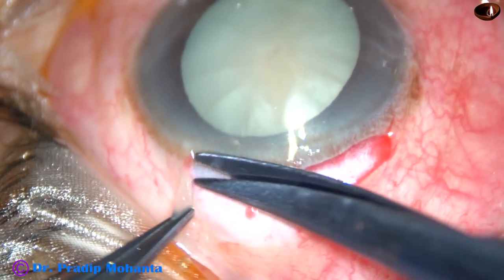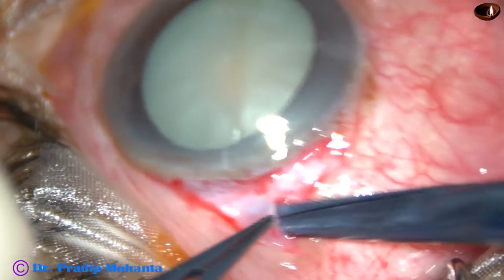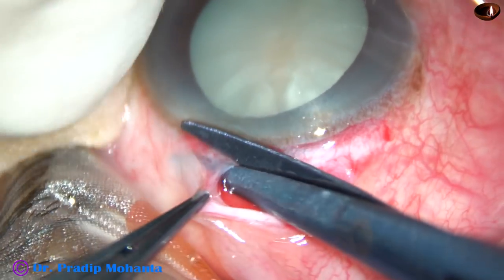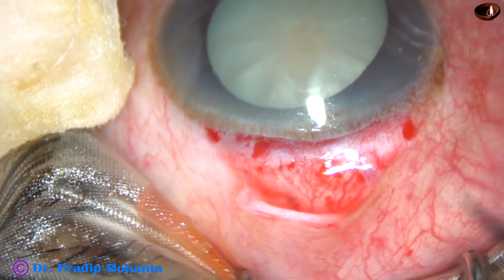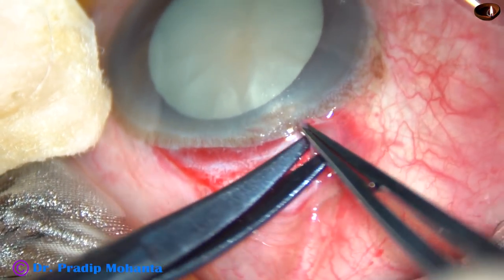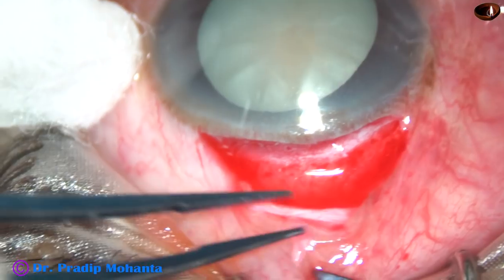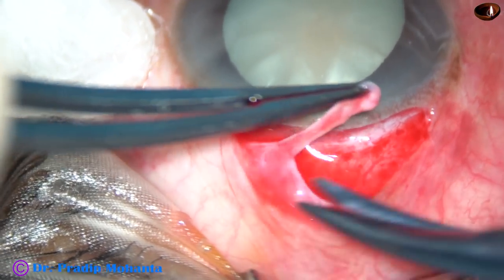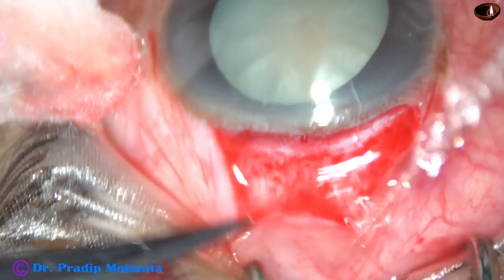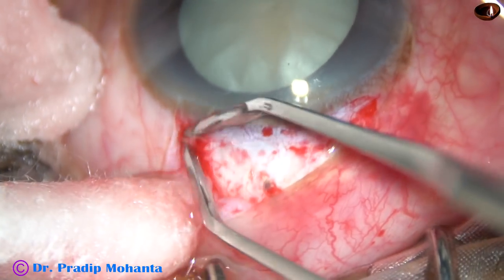Conjunctival peritomy has been done and now the tenon's is incised and cut. Its attachment near the limbus is cut and the tenon's is trimmed a little bit. Because sometimes if the conjunctiva retracts, the tenon's gets exposed and there is a possibility of tenon's granuloma formation. So it is better to trim the tenon's a little bit.